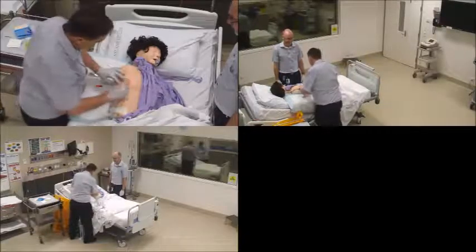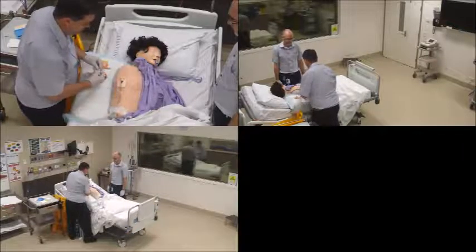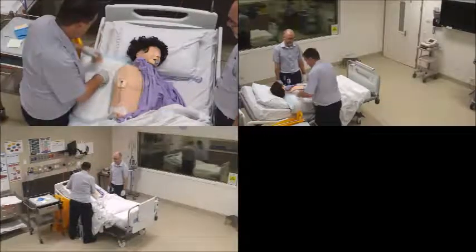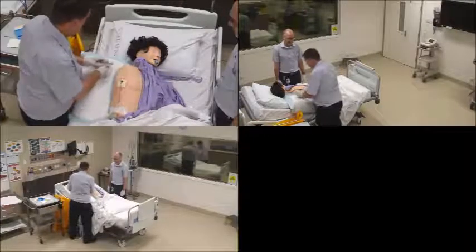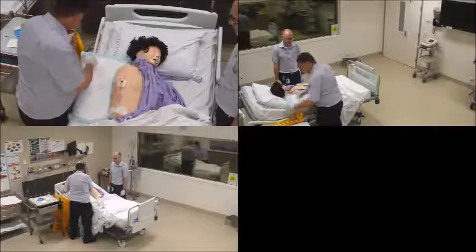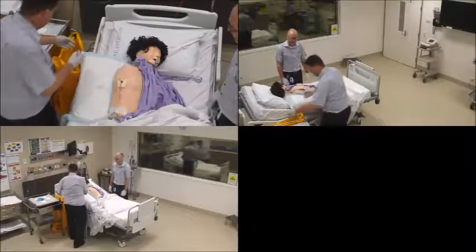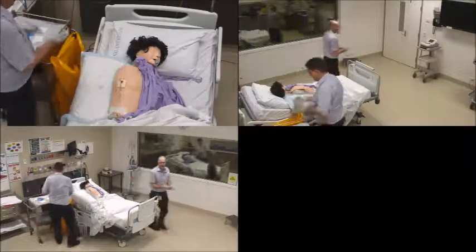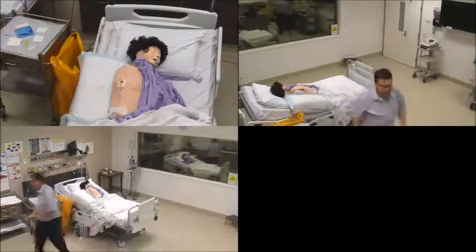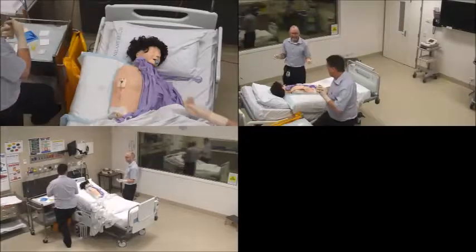So just a bit cold, I've just got some remover wipe to go over the top. Alright, so Kim and I will go do our sterile wash now. When we come back, again we'll clean around with some saline. There's a stitch that needs to be removed, and then we shall take the drain out. Okay, take it in a minute.